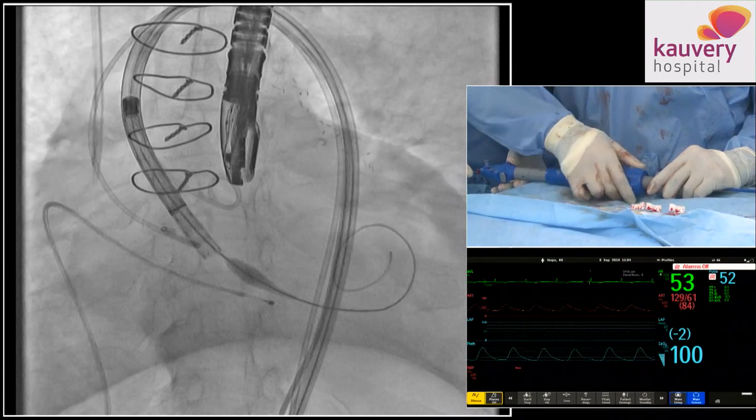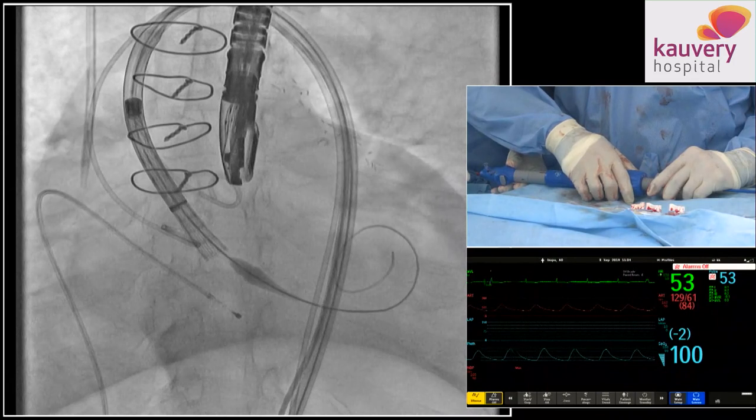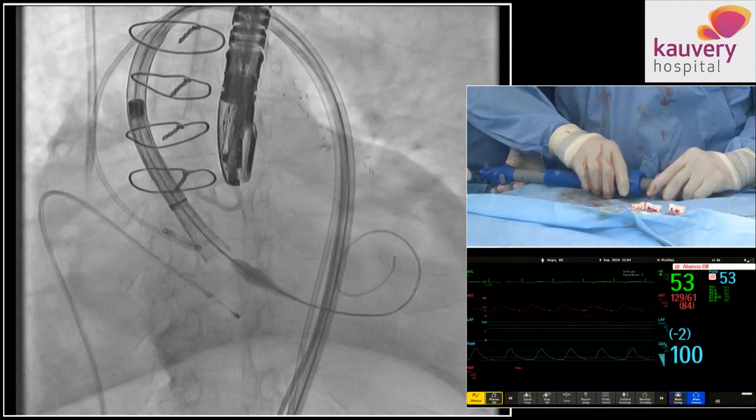Slow. Back a bit. Very slow. Okay. We're starting to flare. Yeah, it's starting to flare. Now just hold on. I'll come a little gently. Bit back. Okay. That's enough. Okay. I'm going further.